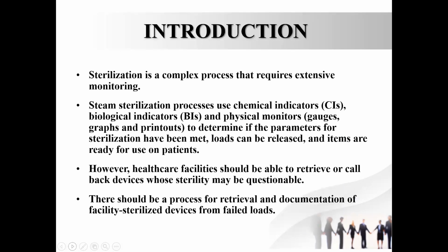So to introduce the topic of recall, sterilization is a complex process. We have to monitor it extensively. To monitor this process, we normally use chemical indicators, biological indicators, and physical monitors. What are physical monitors?